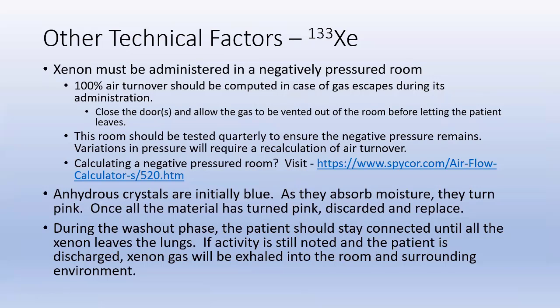Several other factors about xenon 133, which I'm assuming most of you probably are not going to be utilizing, but I think it's a critical issue that we need to discuss in case xenon is actually utilized in your institution. And the first thing is that if you're doing xenon, you have to have a negative pressured room, which means you have to calculate the actual amount of time it takes for the air to turn over in the room. That is 100% turnover, as I have here.